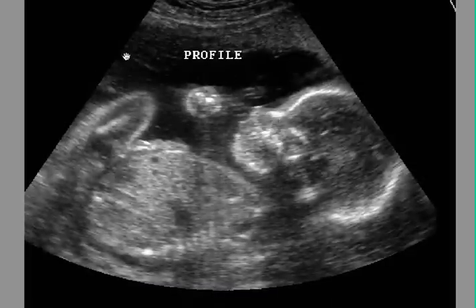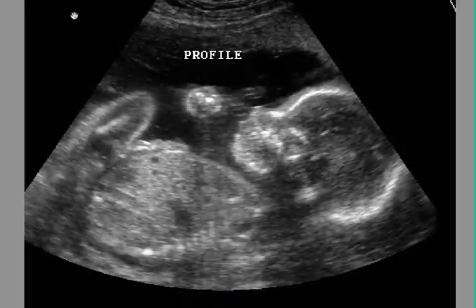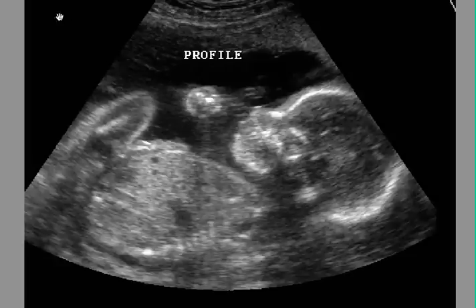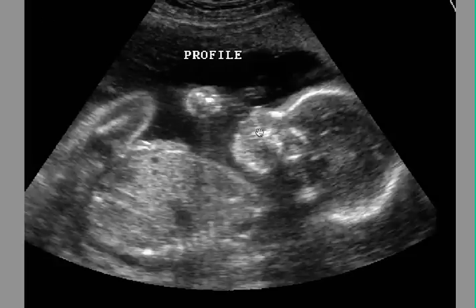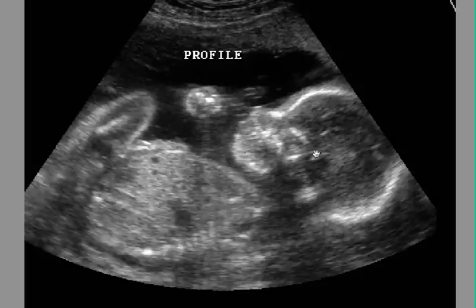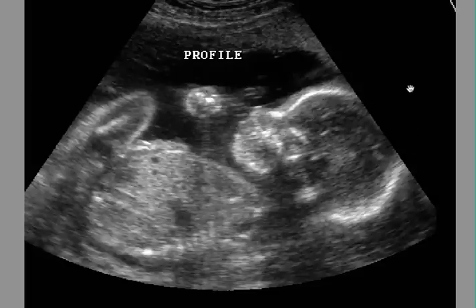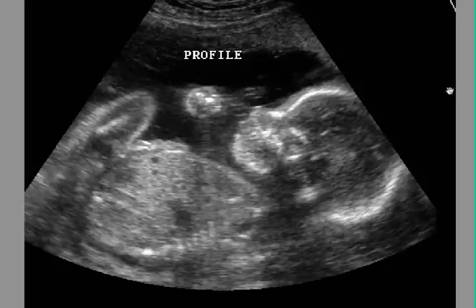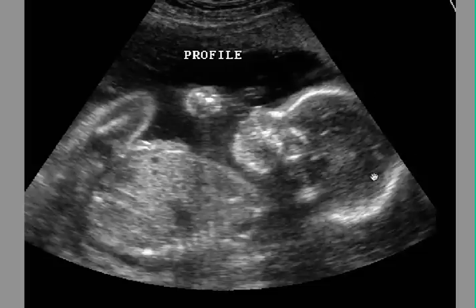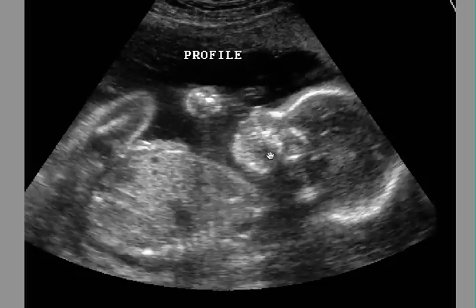This is our first ultrasound image. Imagine the dot right over here on the left side — we're scanning with the dot pointing up, so this is the up direction. You can see that the baby's head is down. This is a vertex presentation, and the birth canal is on this side because this is down. So this is what we want to see: the baby's head is down.